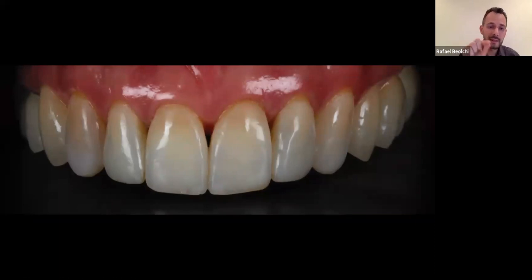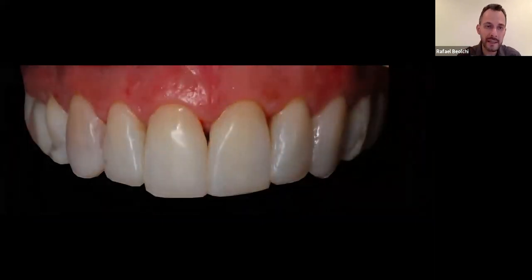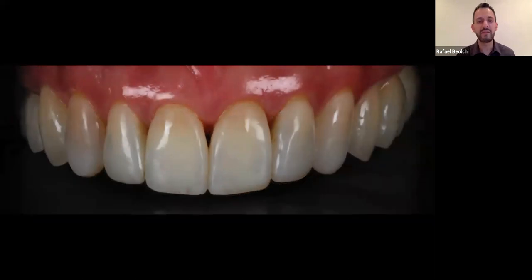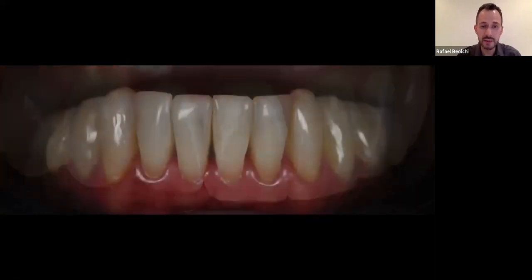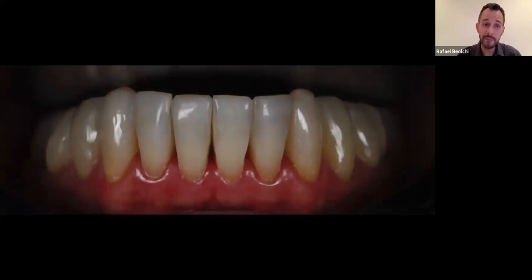And this is what we see after I did the whole procedure, upper and also on the lower. And this is how I started. This is how it started. You know, when she came back after 3 months, that's the situation I had. When I did the finishing, this is the final situation of this case. So we can see there's a lot of shine there. This is the idea. Also here, the lower, I'm really happy about the lower because really, it is really tall. It is hard to see.